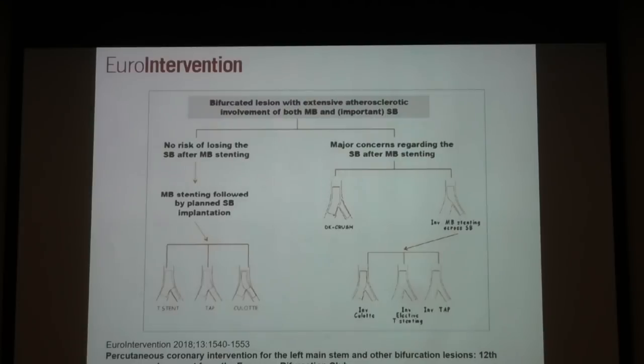أنا بحكي إنه كل واحد should adopt one main strategy for left main stenting. And then he uses that in about 60-70% of all left main bifurcations. And then he uses special techniques specific for selected group of patients. ليش؟ Then once you are proficient in one stent strategy or one PCI strategy, ممكن تكون one stent, تكون two stent strategy, you become really routinely aware and performing it better and perfecting it better.